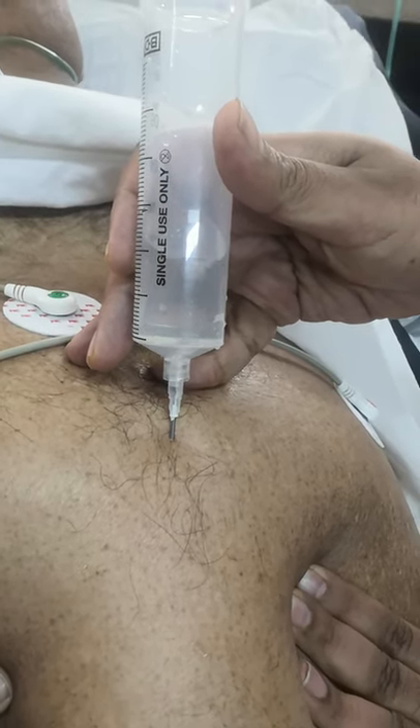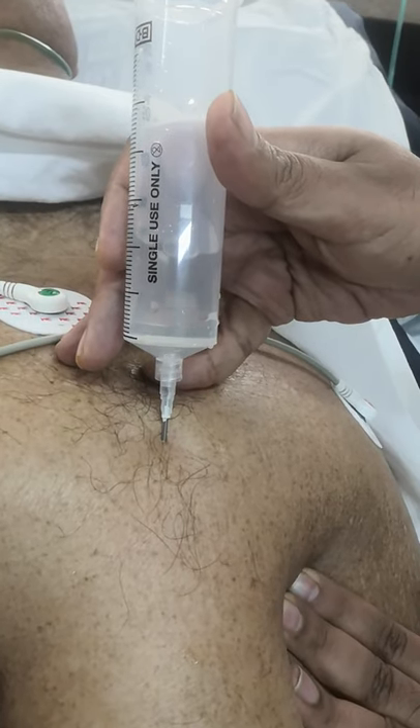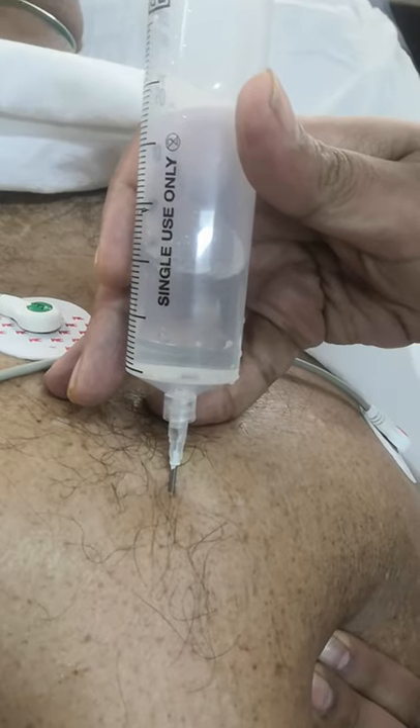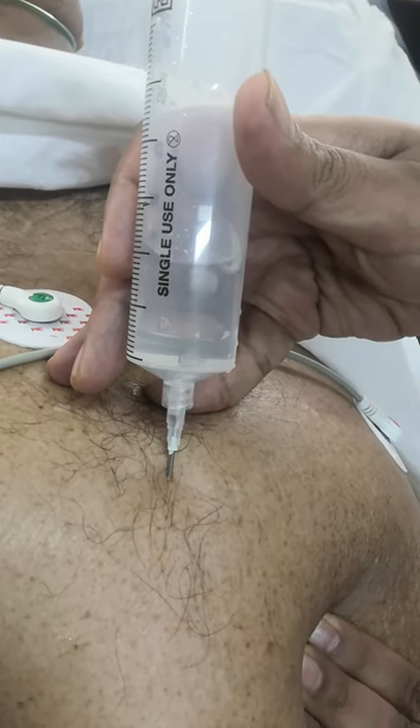So what we did, we simply put a needle inside with a water column above it. We have confirmed that now we are removing all the extra air in the peritoneum.